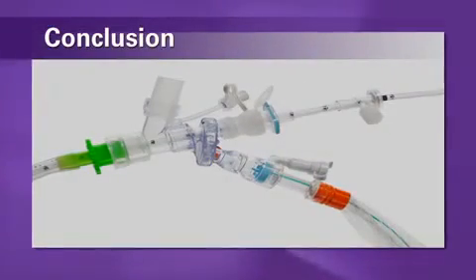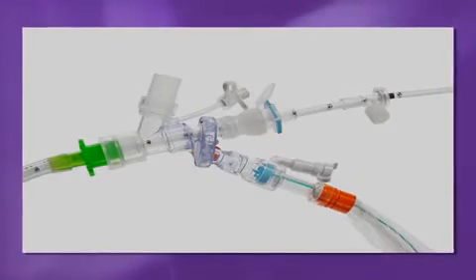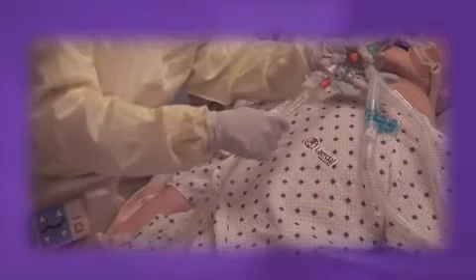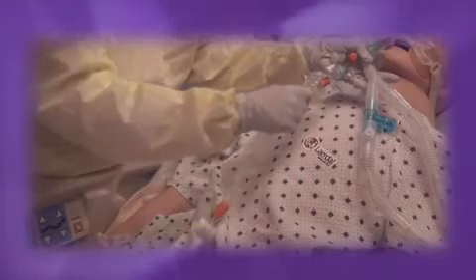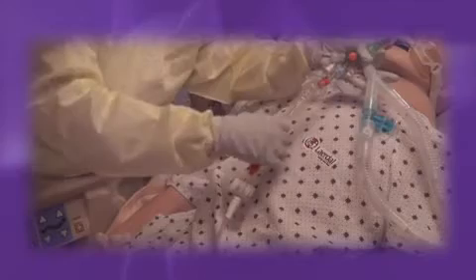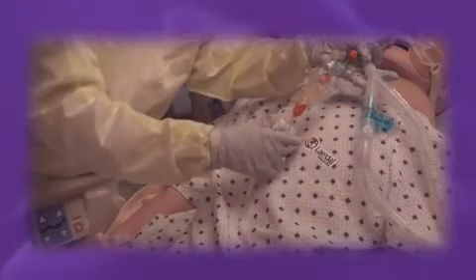As we have demonstrated, the Kimvent Multi-Access Port Closed Suction System is designed to be compatible with both the Kimvent Valcath Bronchial Aspirate Sampling Catheter or a bronchoscope. Clinicians can now safely and quickly obtain a lower respiratory tract sample that provides an accurate lung infection diagnosis for targeted antibiotic treatment without opening the ventilator circuit. The Kimvent solution, the multi-access port, and Valcath allow clinicians to clear and diagnose the patient's airway.